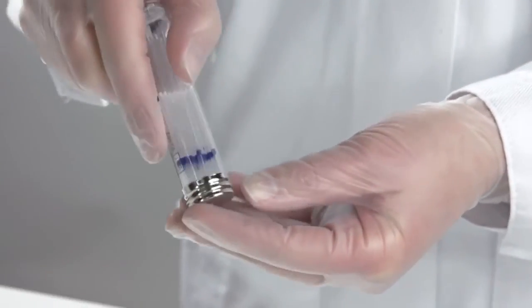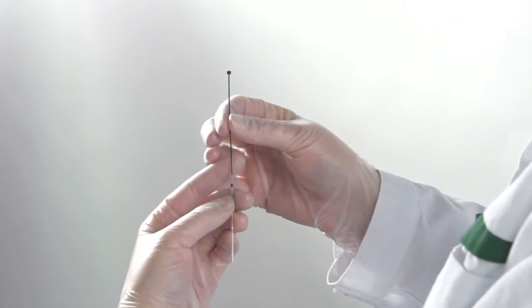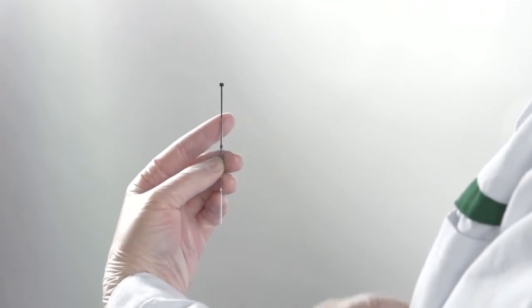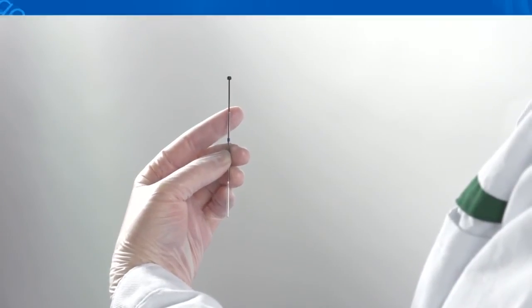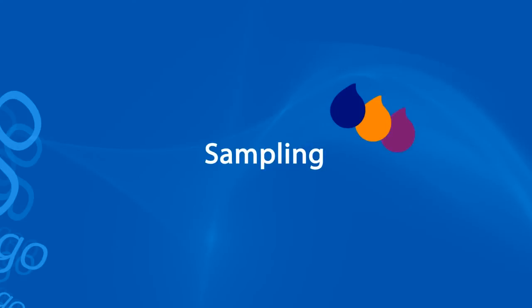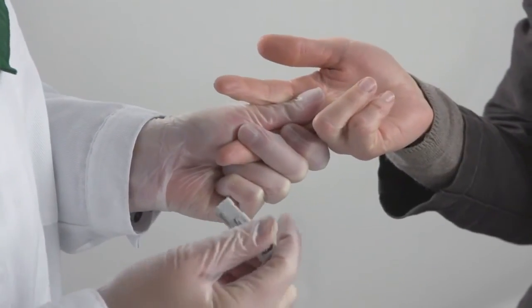Take a capillary and a plunger out from the tubes and insert the plunger into the capillary from the end with the blue line. Supporting the capillary in the upper end with a finger helps to get the plunger in. Hold the finger tightly and press gently.